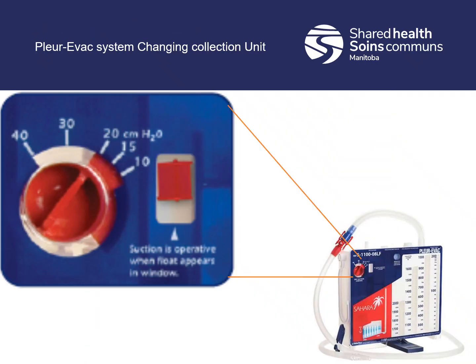Then we're going to make sure that the dry suction control in the new collection unit is set to the same settings as the original collection unit, so we maintain the correct negative pressure. They always come at -20, but let's say the physician that sent you on the IFT with his patient on this collection device had it set to -15. We would want to make sure that our new collection device has been set to -15 as well, so that they're matching and we're not affecting negative pressures.